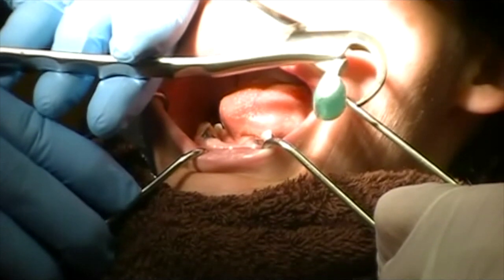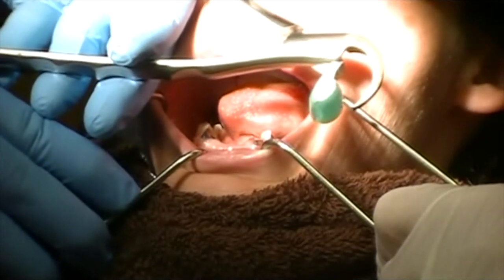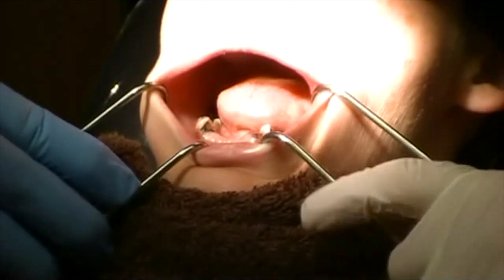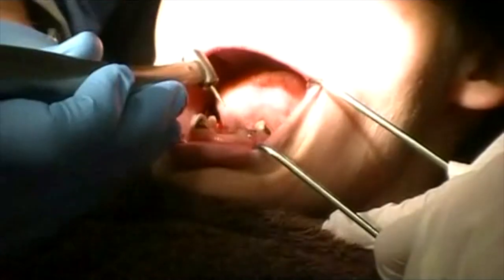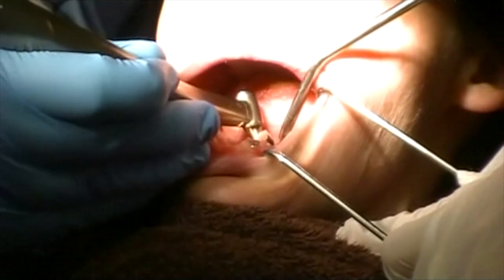Now here it's very important because my plan is to immediately place some implants, so we want to maintain that buccal bone as much as possible. So what I'm going to do is go ahead and flatten the surfaces as we did before.